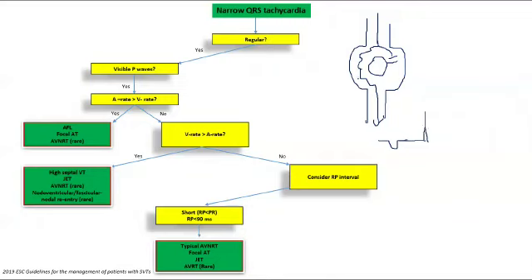But because we have slow conduction here, as this impulse is traveling down the slow pathway, it's actually giving time for the fast pathway to also recover from its refractoriness. Yeah?